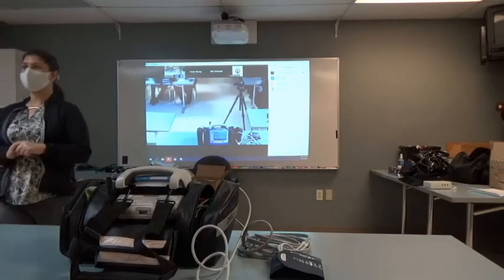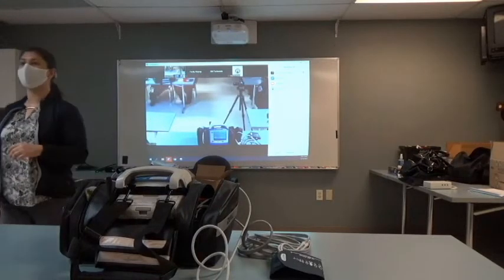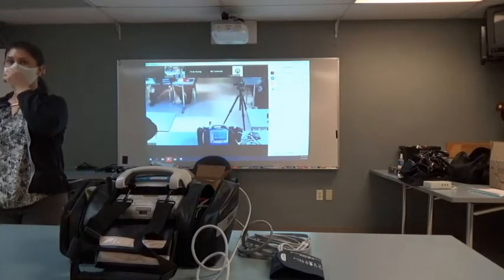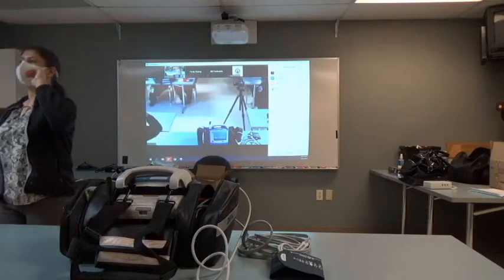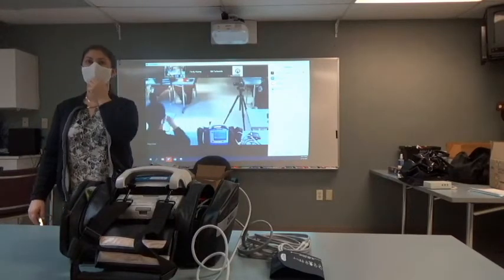Manual defibrillation, you're just gonna follow the 1, 2, 3. Or are you guys 200 across the board for everything? 200. Okay, so you can just hit the charge button as long as you guys are at 200. You'll just hit the charge button twice. Just confirm that you're at 200. How long does it take before it dumps itself? 60 seconds. Oh, wow. So we're going to talk about that in just a second. Go ahead and deliver the shock.